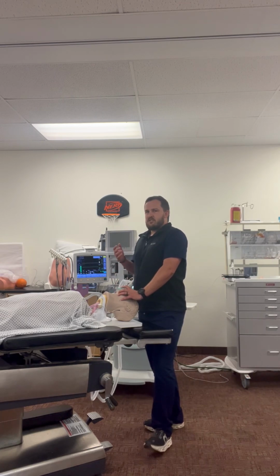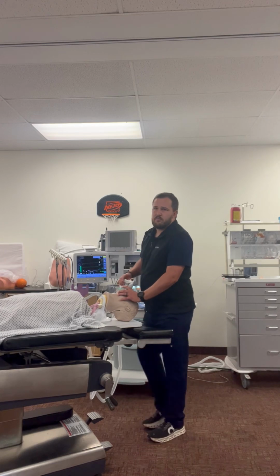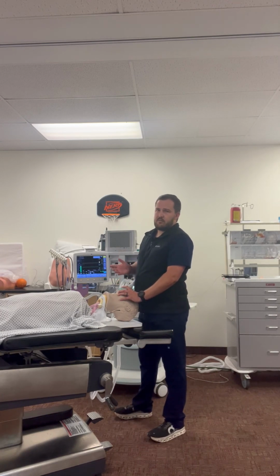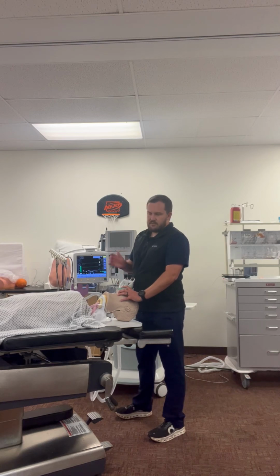Once I reach stage 2 anesthesia, this is the excitatory phase. I will probably see agitation, I could see breath holding, tachycardia, dilated pupils. Any stimulation needs to be avoided because it does put the patient at a high risk of laryngospasm.